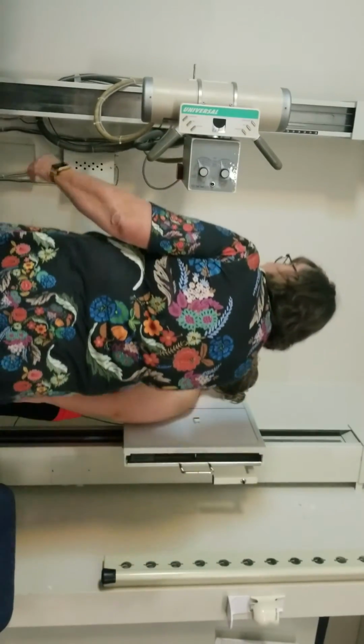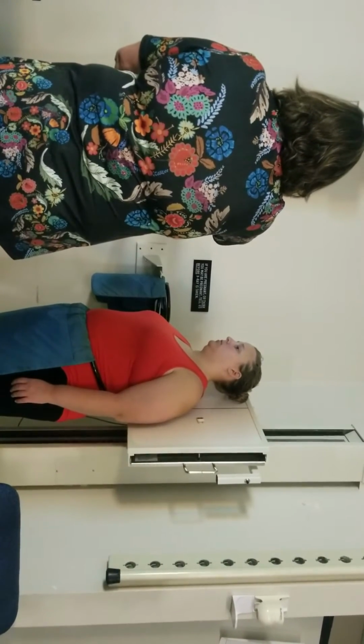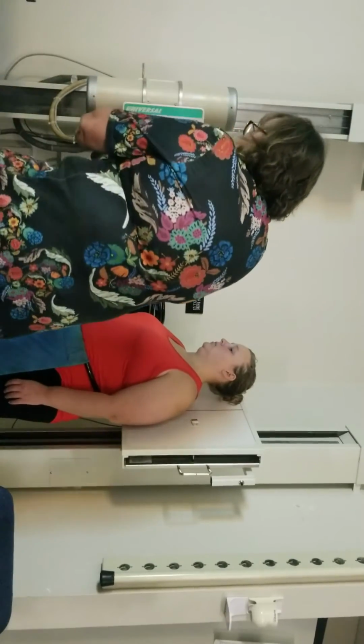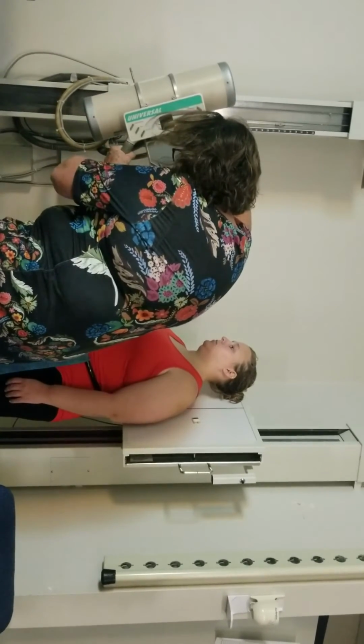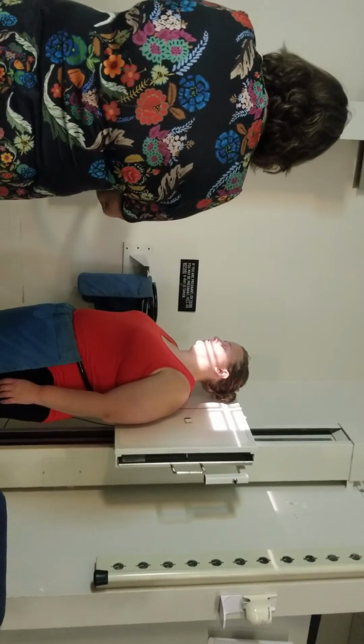Now, the next one we're going to do is an axial. So I'm going to roll my tube 15 degrees. So from 90, that'd be 105. And once again, sorry, Ellen, if I got that in your face.